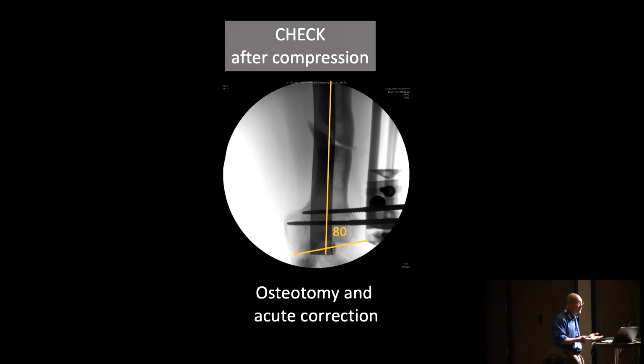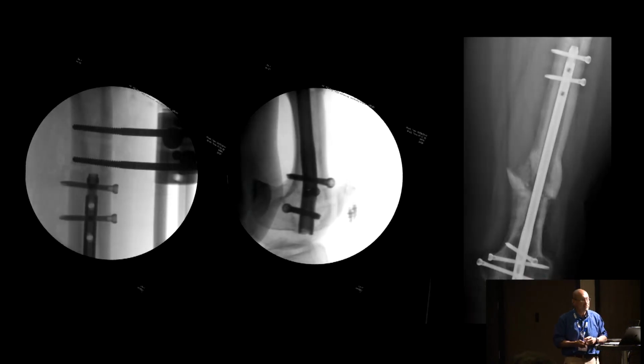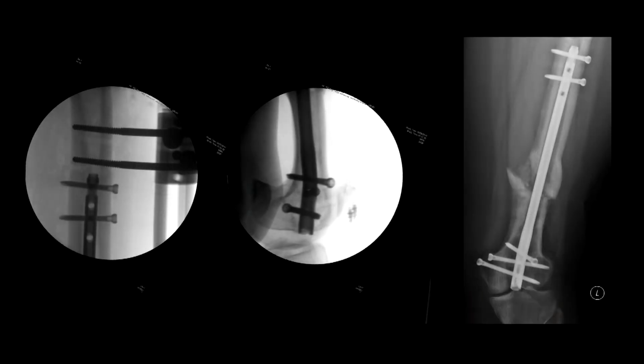Once you've done that, you compress the osteotomy with the external fixator. That's a quality that rail fixators will allow you to do. Of course, you can do it with a hexapod too, but you'll have to program that in the correction that you achieve. And while that compression is being maintained, you perform your reaming and obviously the introduction of your intramedullary nail.